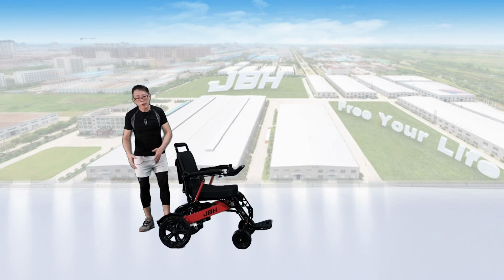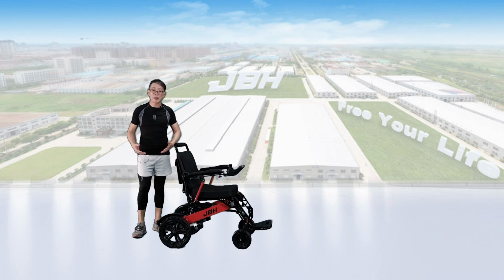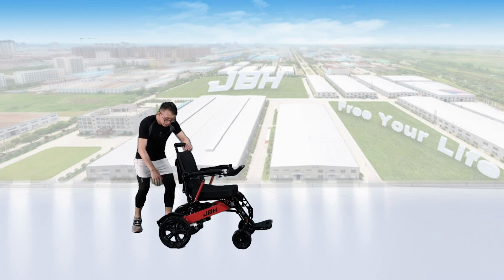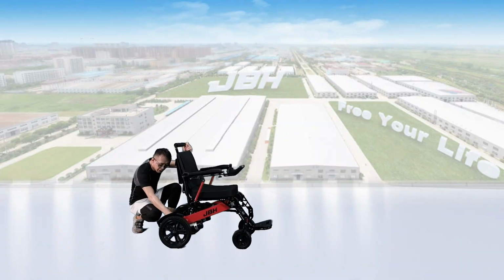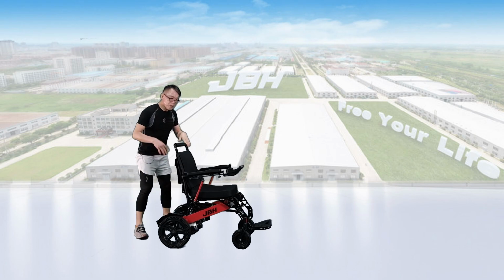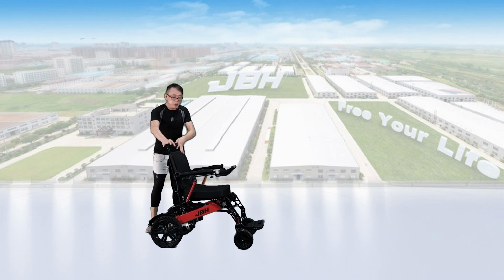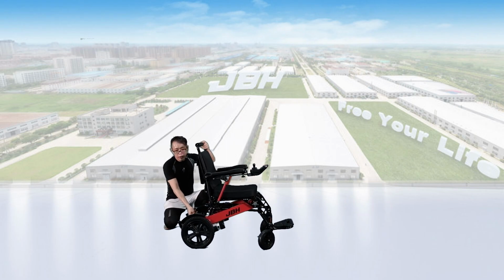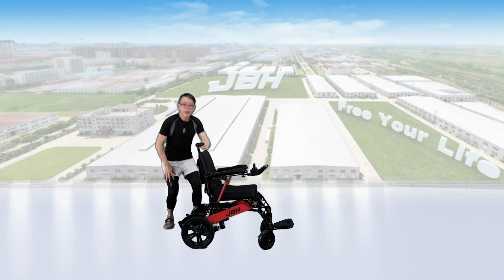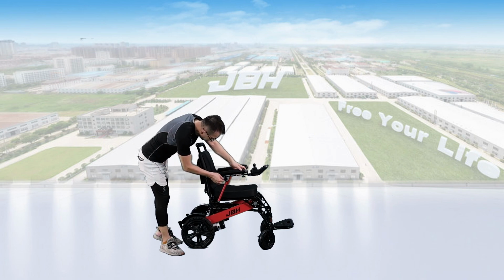On the back, there are two levers that allow us to switch the wheel mode. If you want manual control, simply pull the lever to the back. It's a kind of rotation to the back on both sides, and then we can push the wheelchair by hand. It's really simple and easy. If you want electric control, simply rotate the lever to the front, and then we can drive the wheelchair around, ready to go.